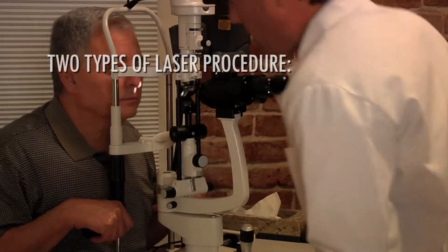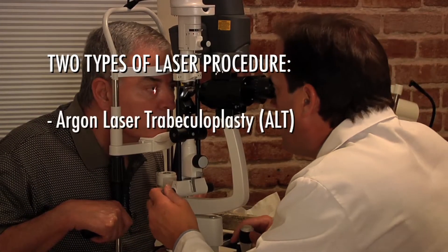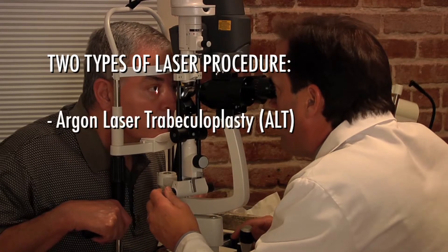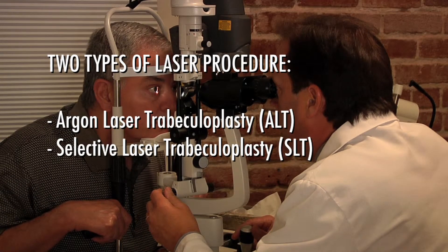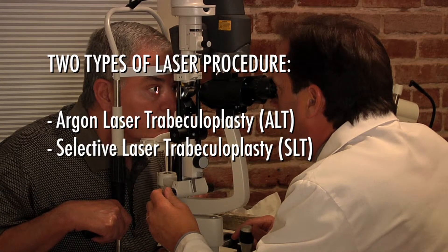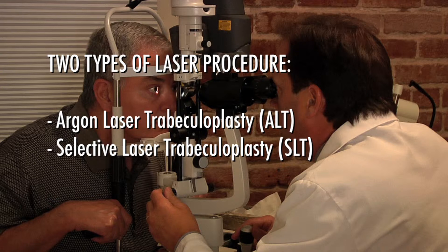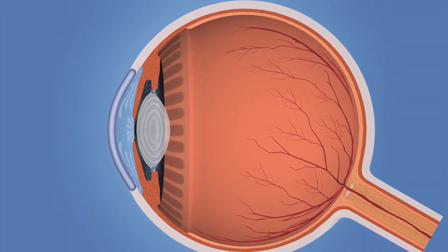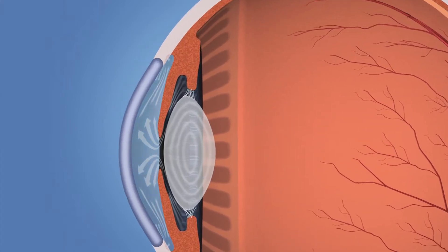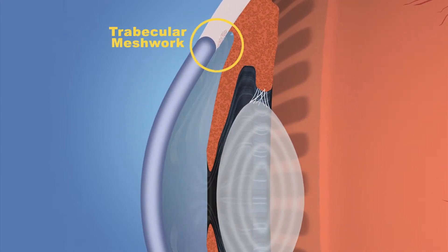Two types of laser procedures, called argon laser trabeculoplasty, known as ALT, and selective laser trabeculoplasty, or SLT, are used for patients with open angle glaucoma. These laser surgeries are used to treat the drainage system of the eye, known as the trabecular meshwork.